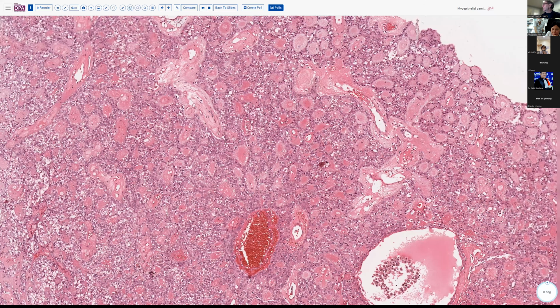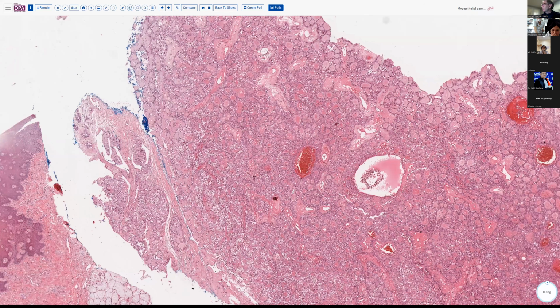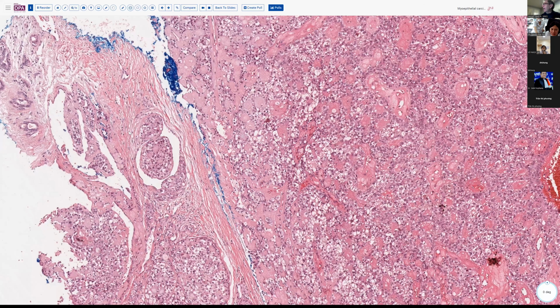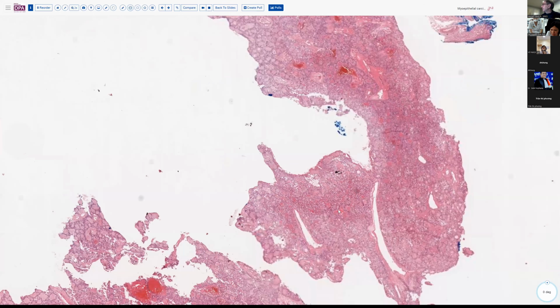So we'll look a little bit more at this case and see if we can identify other features that identify malignancy. Here you can see one that might be suggestive. This looks very much like you may have intravascular spread. Here, as you see, an endothelial lined space here and one here with subendothelial growth and intraluminal growth of the tumor. Those are usually bad prognostic signs and probably partly explain the behavior of the tumor to have distant metastasis ahead of local or regional metastases.